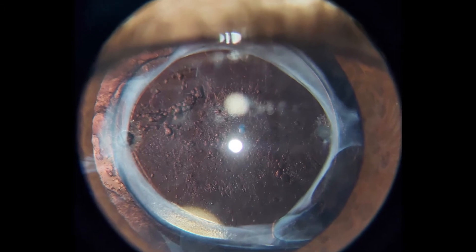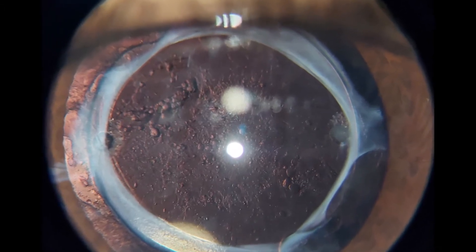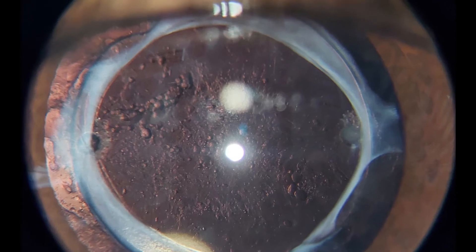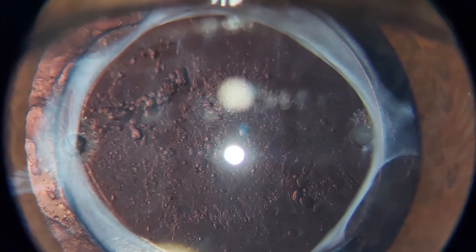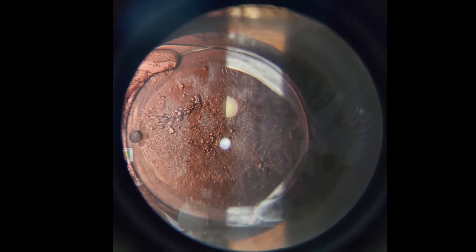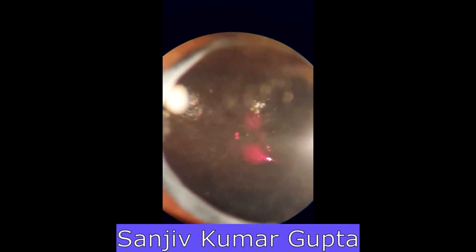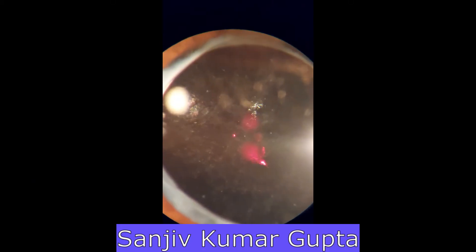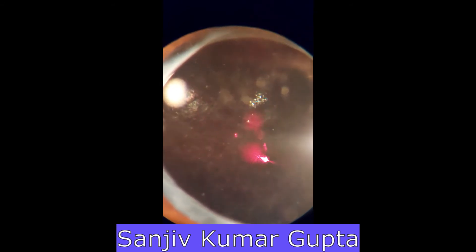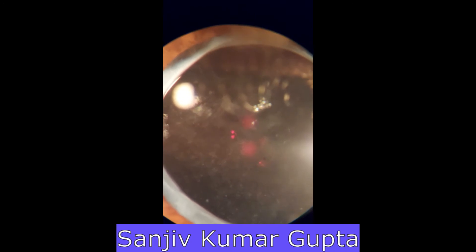These are pictures of the patient in direct illumination, where we can see the Elschnig pearl type of capsular opacification. This is in retro-illumination, and we can appreciate that this patient has extremely poor vision because of this capsular opacification.